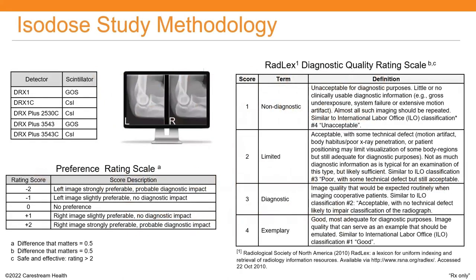So the greatest risk of denoising medical images is the possibility of inadvertently removing important information. The assessment of this risk can be accomplished by performing a controlled reader study that forces careful before and after pairwise evaluation of image quality based on expert human observers with suitable domain knowledge.